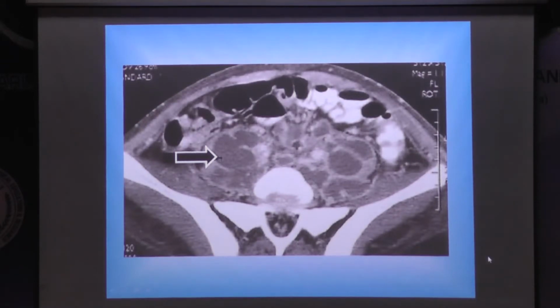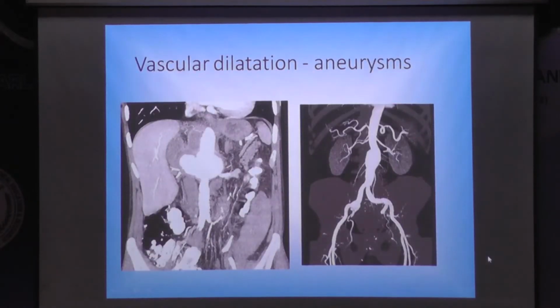So retroperitoneal nodes which are covered by some large viscera, you cannot access. Whereas CT has that advantage where deep retroperitoneal nodes can be seen, and in addition, CT also, if you give contrast, can pick up necrosis in the node. Now, why do you want to pick up necrosis in the node? Necrosis points to mostly an infective etiology, mostly I say, not always, and is an important factor in diagnosing tuberculous lymph nodes, which is an important issue in our part of the world.